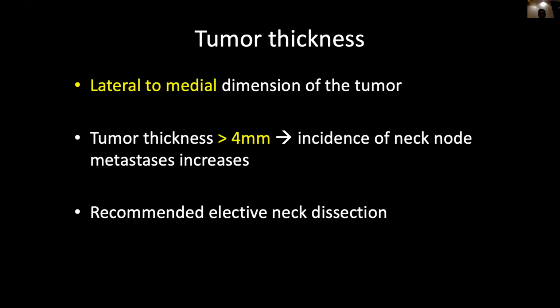So let's concentrate on the tumor thickness and the depth of invasion. The two terminologies are entirely different. Tumor thickness, which used to be used before AJCC 8, is now replaced by depth of invasion, and the two things are different. I'll show you in the subsequent slide.